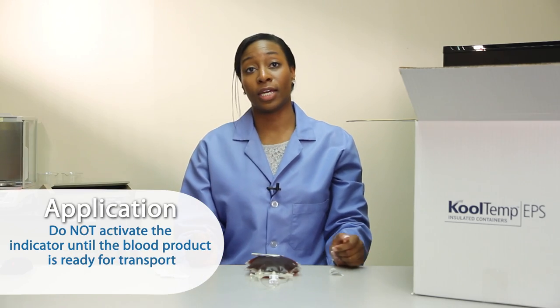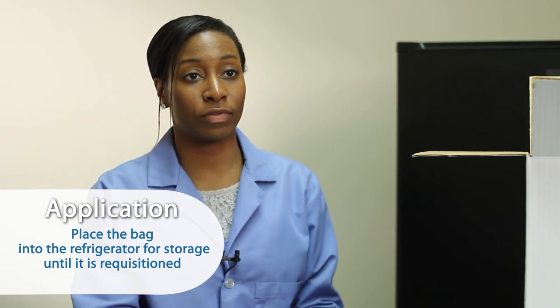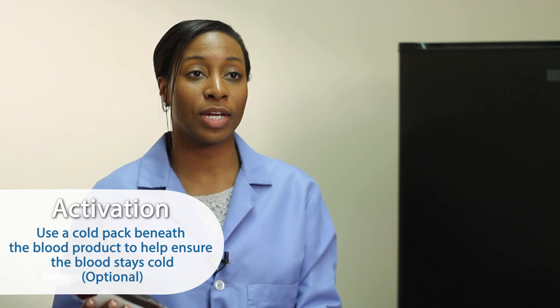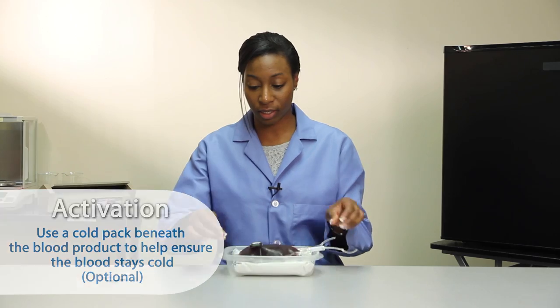Do not activate the indicator until the blood product is ready for transport. Place the bag into the refrigerator for storage until it is requisitioned. We recommend that you use a cold pack beneath your blood products during the dispensing process to help ensure that the blood stays cold.